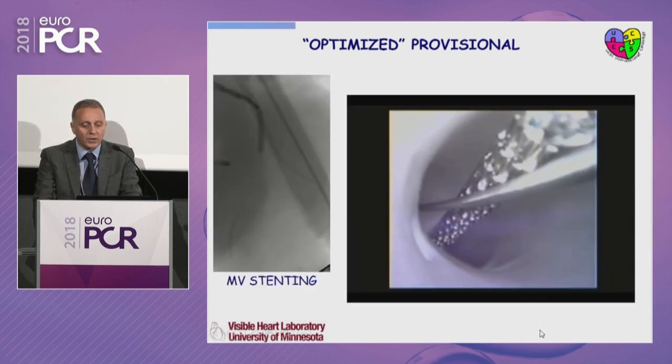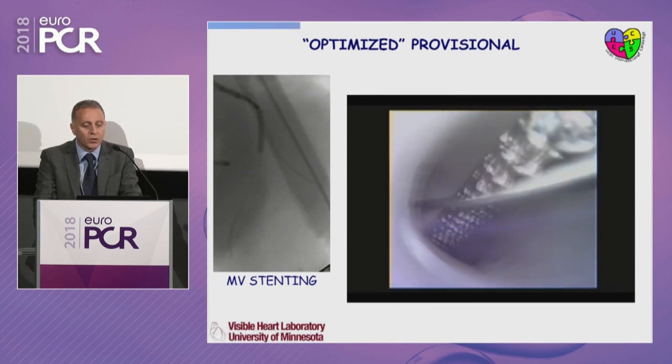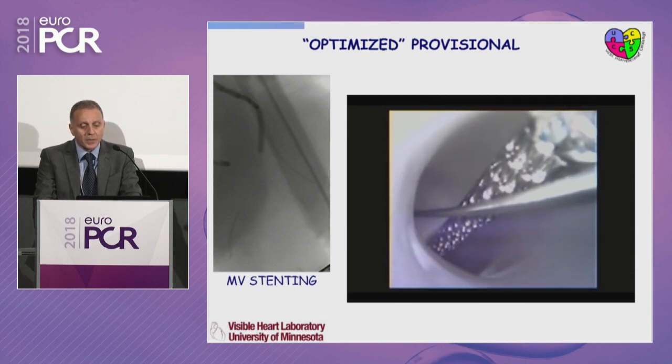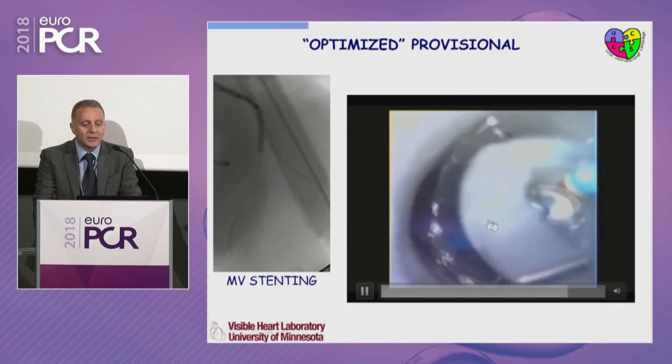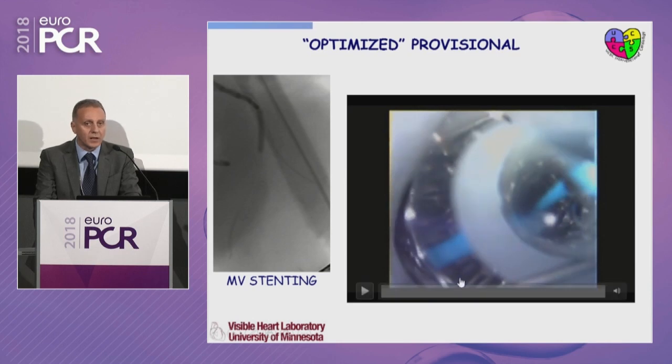This is crossover stenting with the jailed wire, according to the selection performed according to the distality of the main vessel. So you will see that when you do this selection, there is an anticipated drawback, which is this huge malapposition over there. This should be kept in mind, because it is very easy, if you do not correct it, to have a higher chance to induce distortion here and to rewire behind these stent struts.